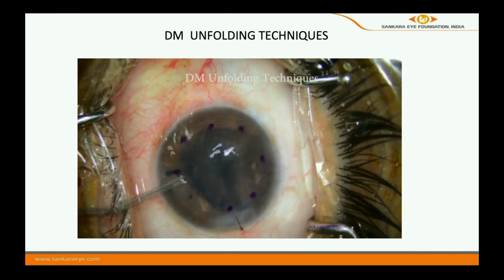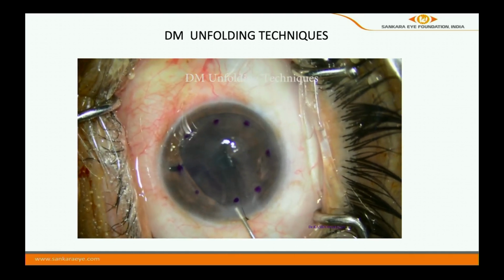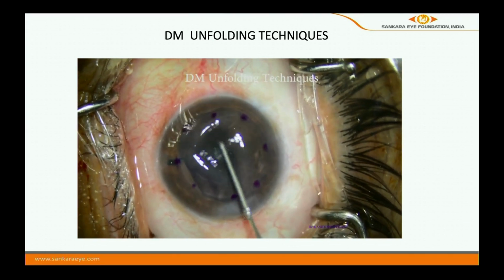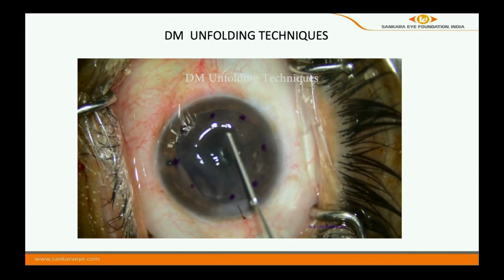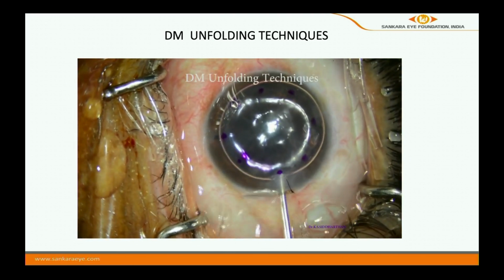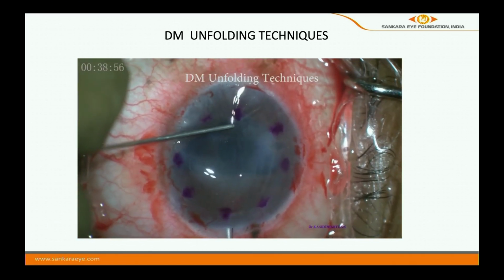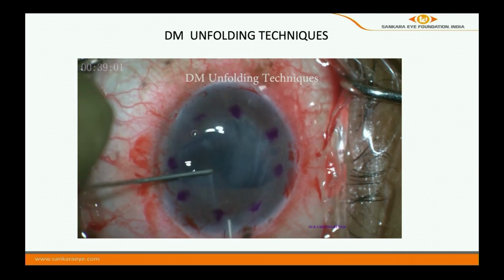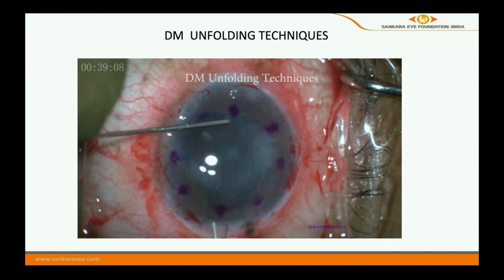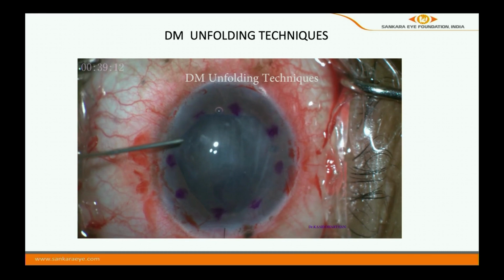So no more rapid tappings, no more vigorous tappings, and you can see that you have to handle the tissue very gently. And positioning is very important. I usually position it very well. I see to it that I position it. It is easy to position, and then the air goes in. Okay. So this is the technique which we currently do. Once you inject, position it horizontally, move it to the desired position, and then I shallow it. I'll be showing you unedited videos, so it'll be easy to see. You might think all these are edited videos.